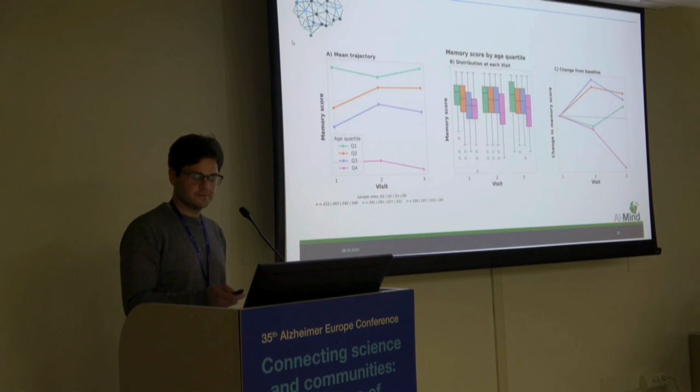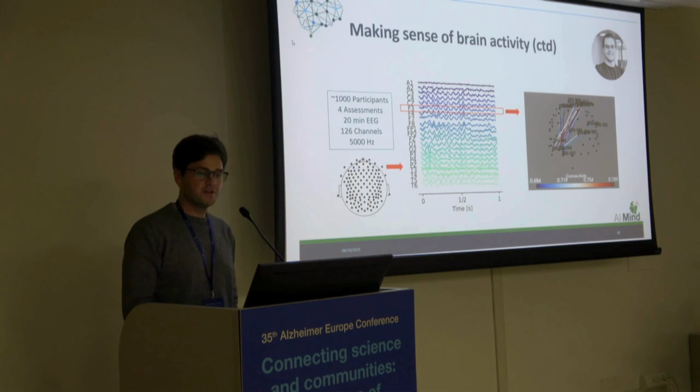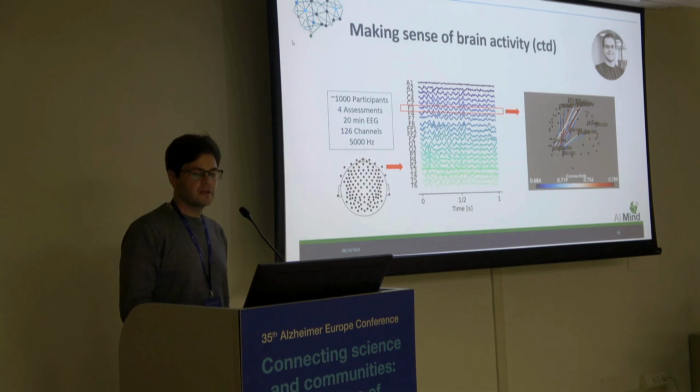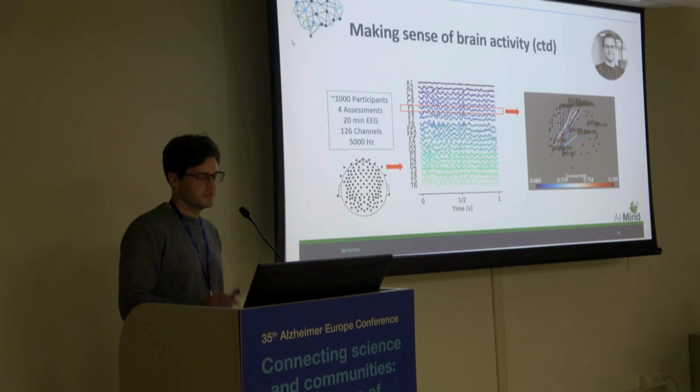A second one is the connectivity. I will not go too much into detail here, but we are also interested in how 2 signals oscillate, or how in sync signals from different brain areas are, and this will give us measures of connectivity, like how strongly they correlate. This is another interesting property of the signal that we are looking into, but it's not part of this talk here.